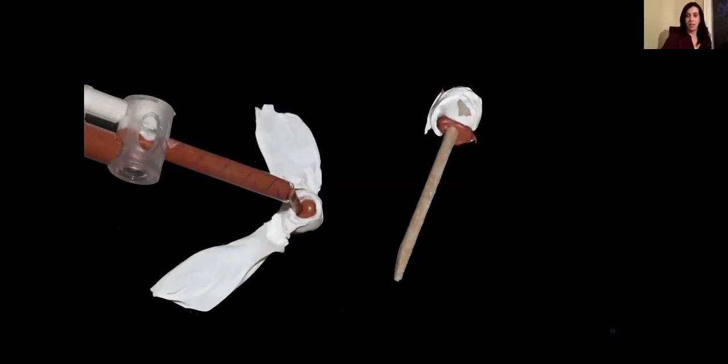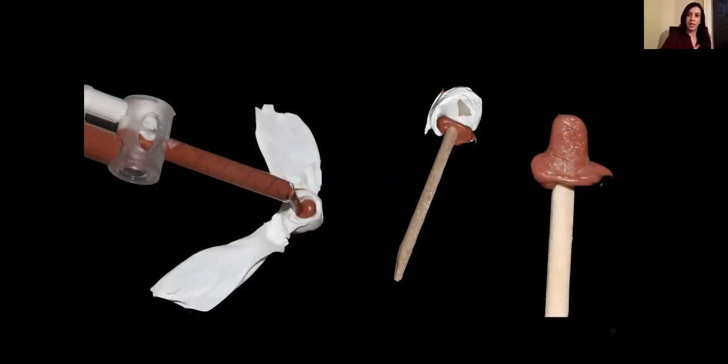And then I attach an end of a Q-tip or a micro brush, whatever you want, to create this sort of holder for the dummy or the duplicate abutment. And here you can see essentially a replica of the abutment that was fabricated for this patient.